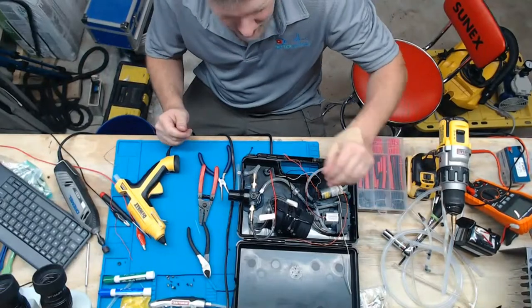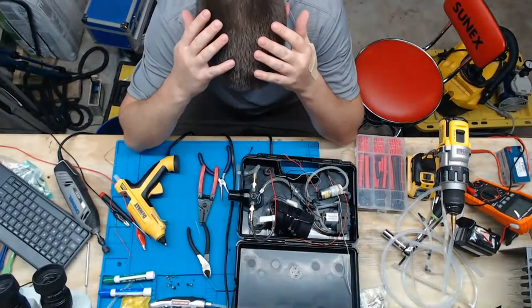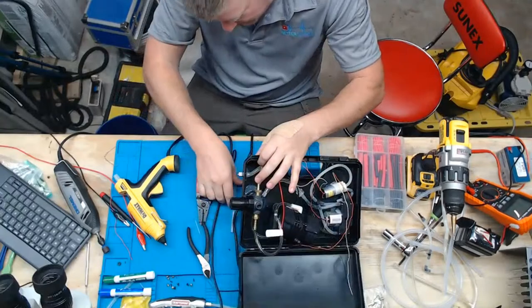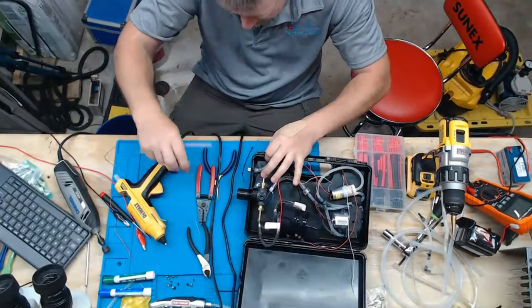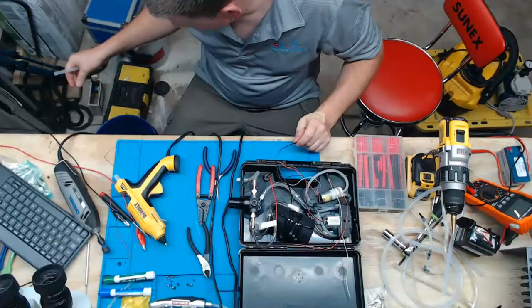So today I'm doing something a little special. I'm making a pressure test jig. And I have to do this because there's certain tests that we do as biomeds that are cumbersome. And I'm going to try and make it a little less so.